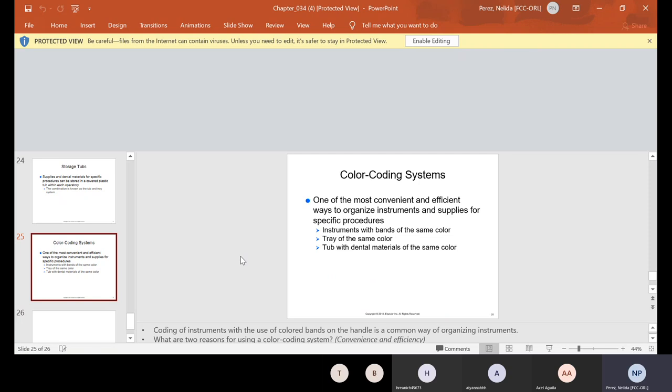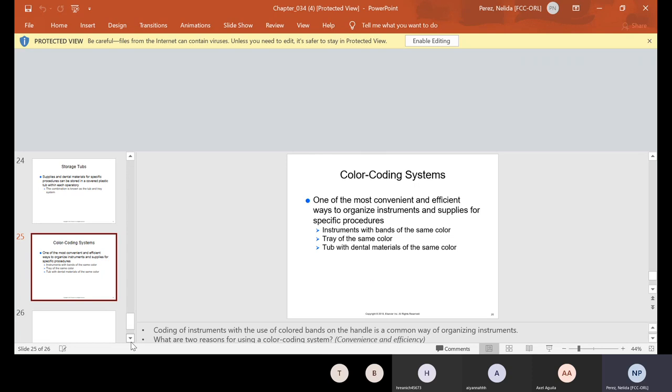So that way, when you're putting instruments away, you know, oh, that's for endo. This is for amalgam, that's for composite. And then the instruments that are used in a lot of procedures, for instance, like I can use a plastic instrument for crown and bridge for composite and sometimes even for amalgam. So it might actually have three colors on it, blue, yellow, and green, or whatever the colors may be signifying that it could be used for other color codes. So color coding, I really like color coding. Cause when you sterilize instruments, you know what group they go in. Does all offices have that? No. Problems with the bands are that they break and they come off with excessive use in the autoclave and ultrasonic.